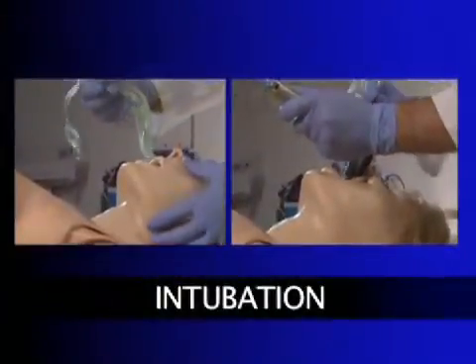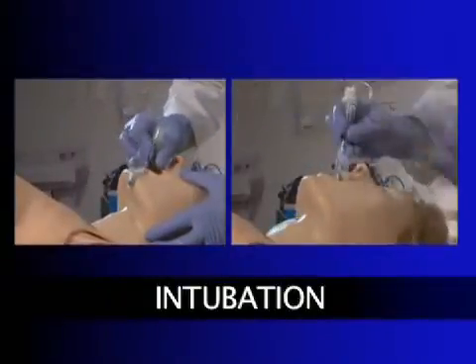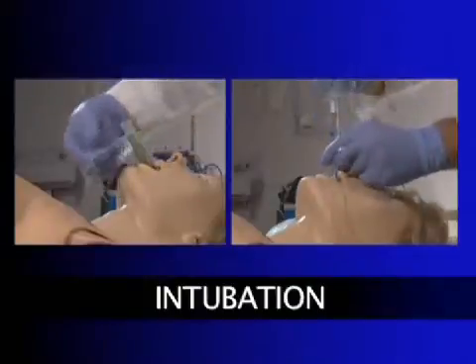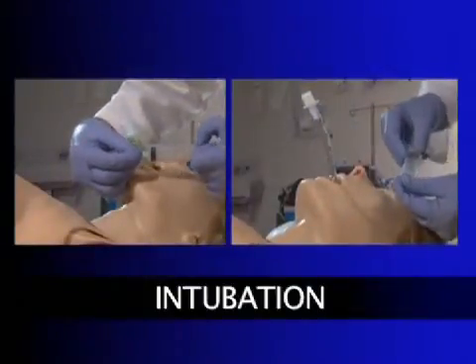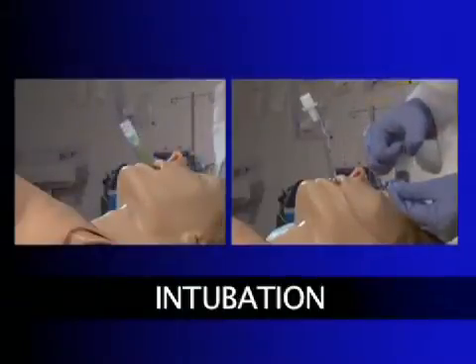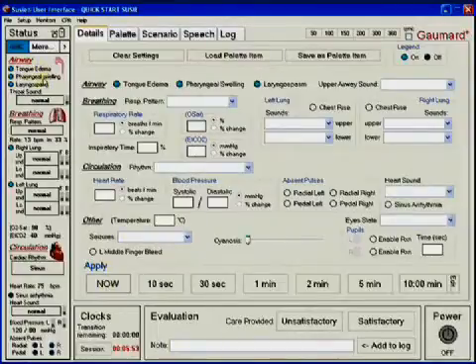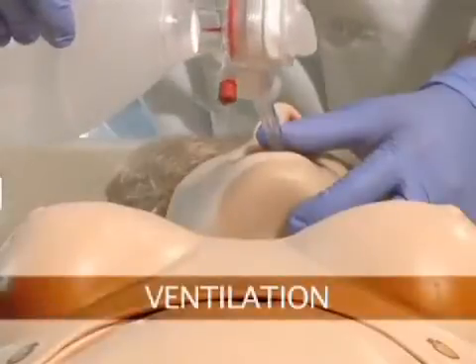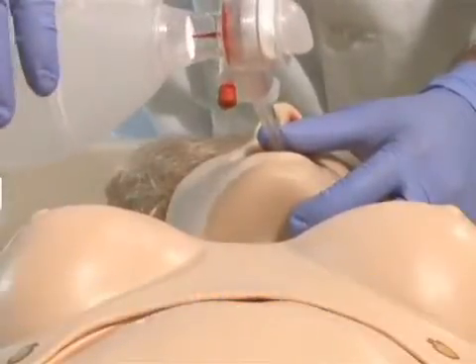Susie's airway can be intubated both nasally and orally using LMA or an endotracheal tube. She can also be used for gavage and lavage procedures. Intubation can be made more difficult by turning on pharyngeal swelling, laryngospasm and tongue edema. Additionally, Susie can be ventilated with a BVM or a mechanical ventilator.